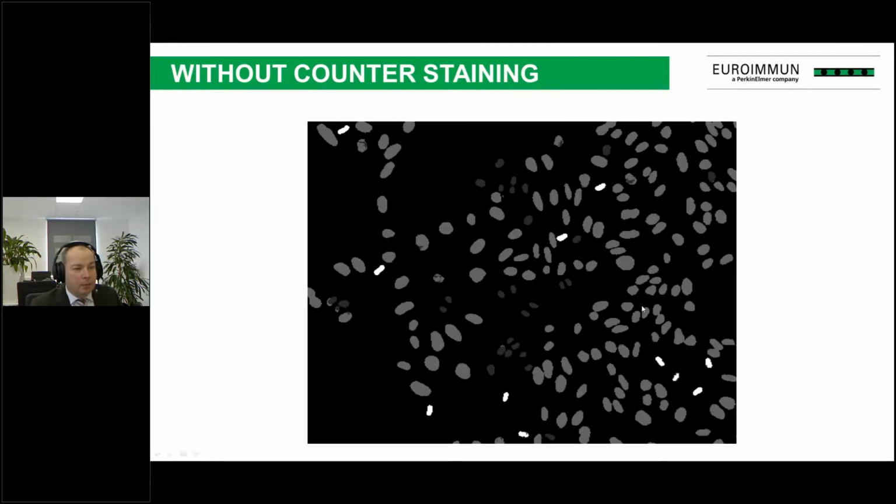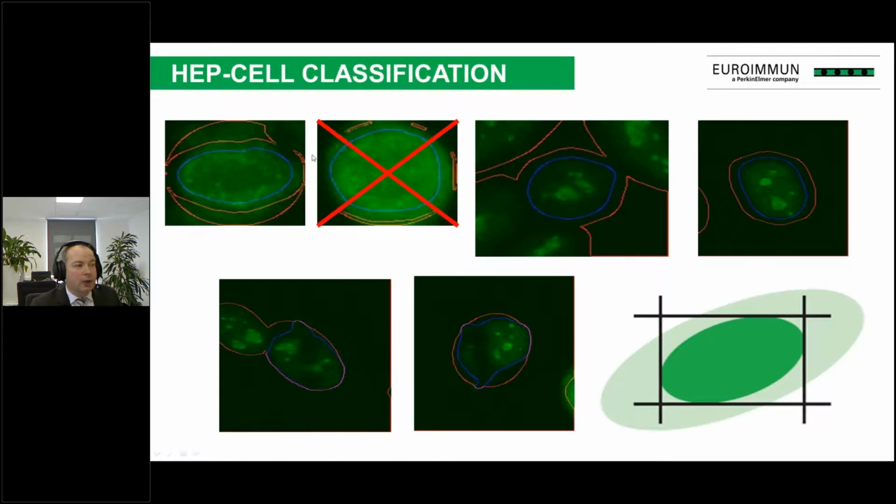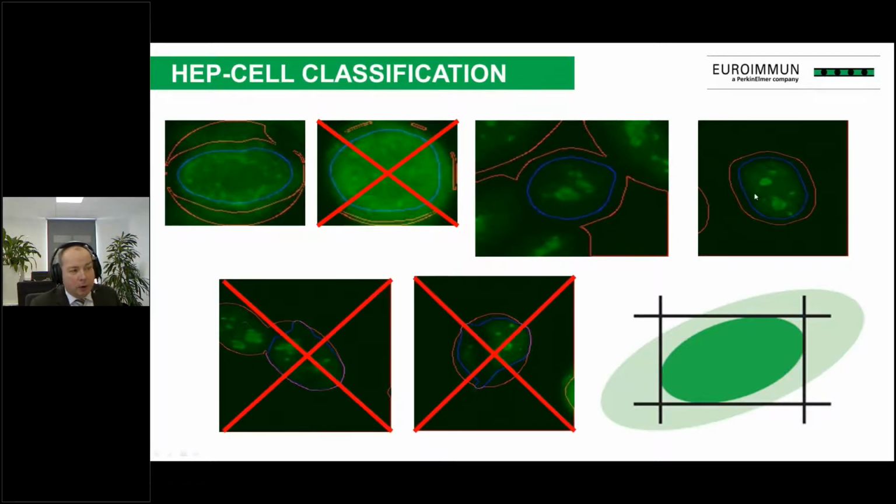Based on this segmentation, we can analyze the green channel in the cells and say, yeah, this is a good mitosis cell for the diagnostic. The shape is correct. These two are correct cells for the diagnostic for the interphase. These three cells can't be used because it's a wrong state, and here the shape is not correct.